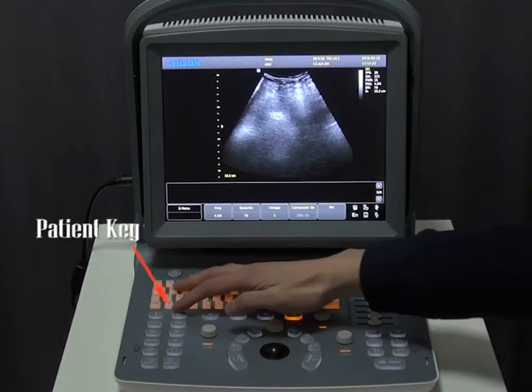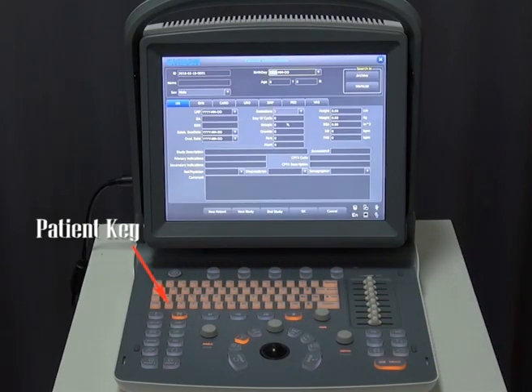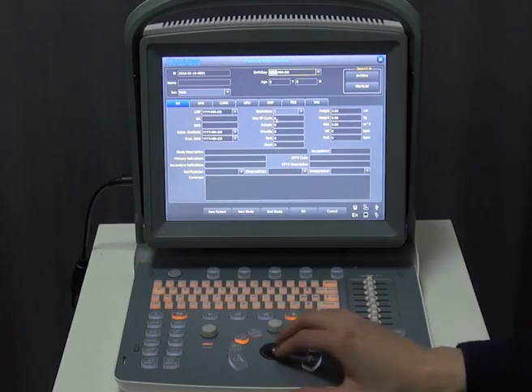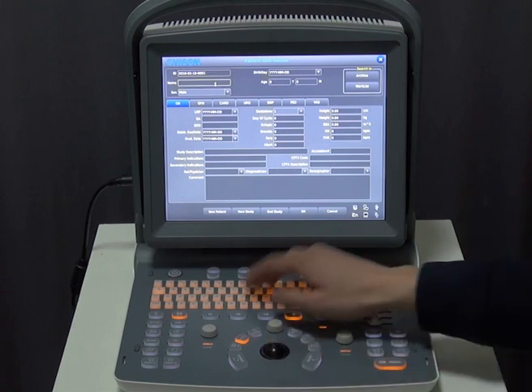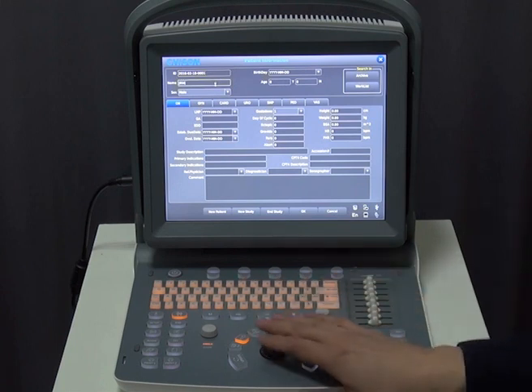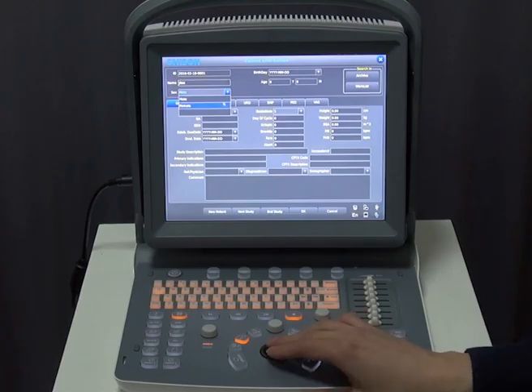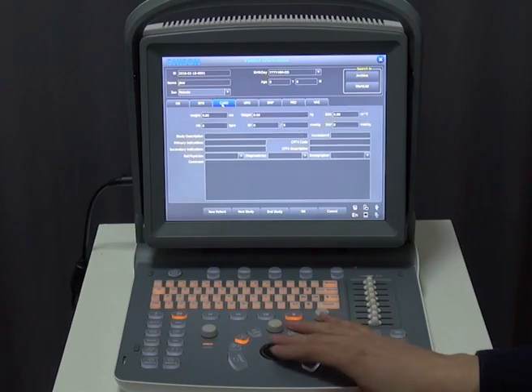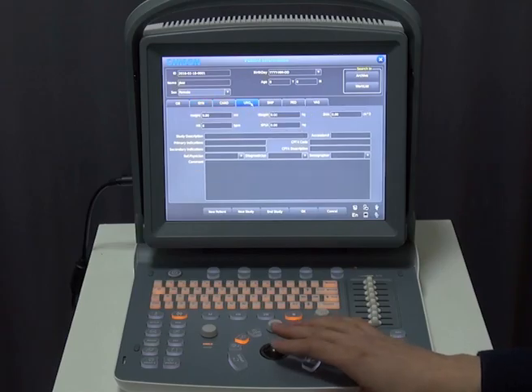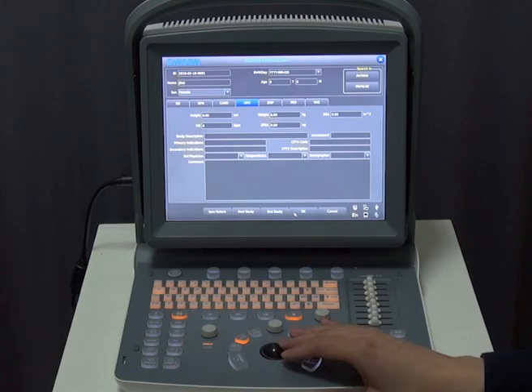When the system is ready, we are going to establish patient information. Use the patient key to start a new patient record. Edit the current patient data — patient ID, patient name — and you can input any other information you want. When ready, click OK to save it.